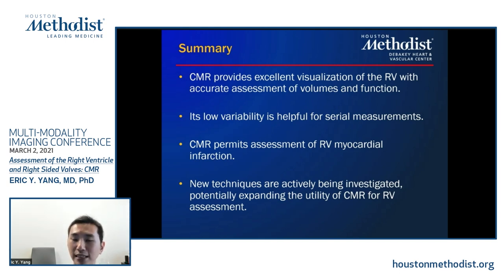It can see LGE in the RV, and if there's RV infarction present or insertion site scar, those are important prognostically. And so we do try to include those findings when we see them in our lab. And there are quite a few new techniques where CMR can not only quantify valves, valve function, valve pathology, etc., but also look at pulmonary pressures and myocardial characteristics, but those are on the horizon and hopefully coming soon in the next coming years as well.